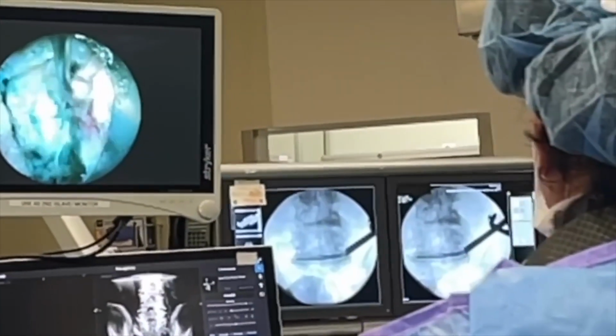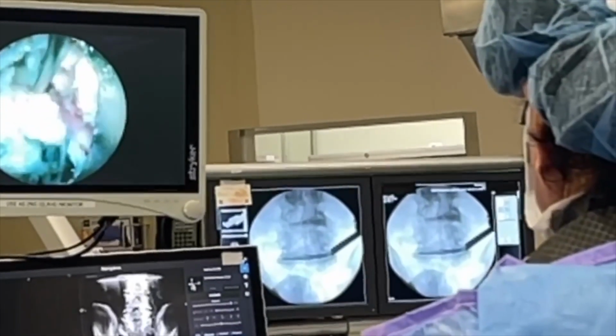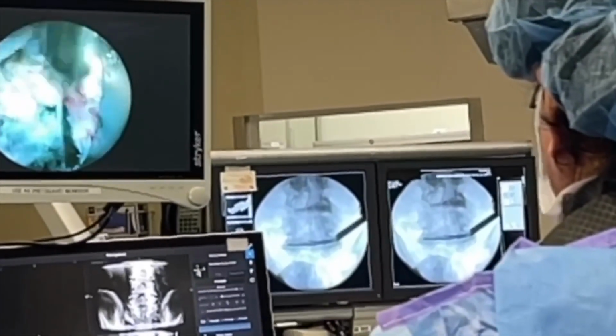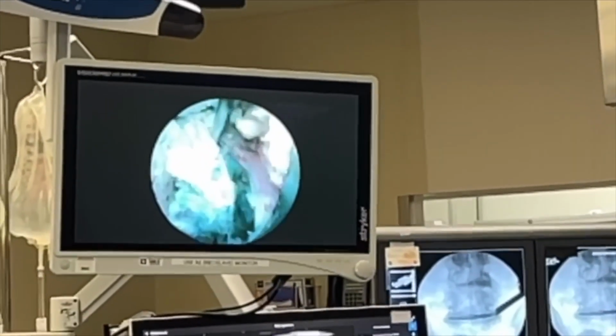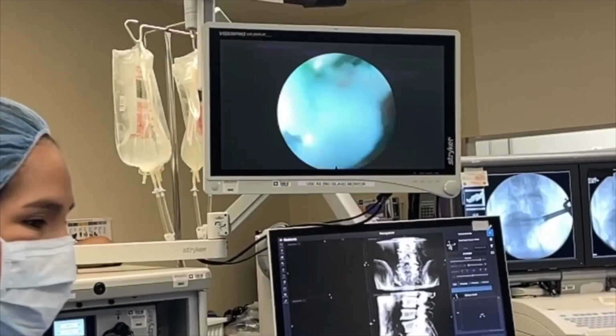Oh, yes, that's going up to the nerve root, just like I suspected. That's the nerve root right there. Don't look at it directly. You'll turn into stone. Look how gentle I am. I'm just caressing it lovingly.